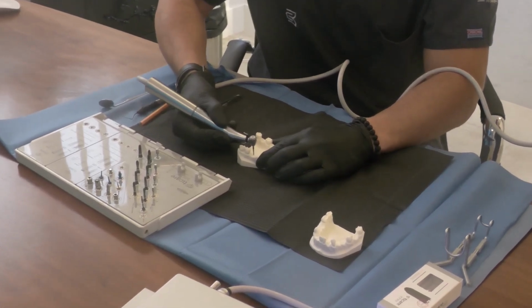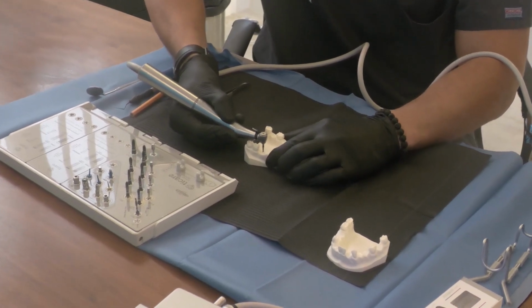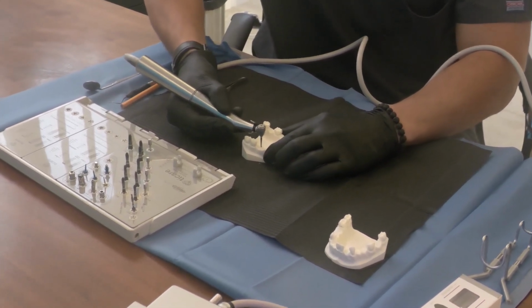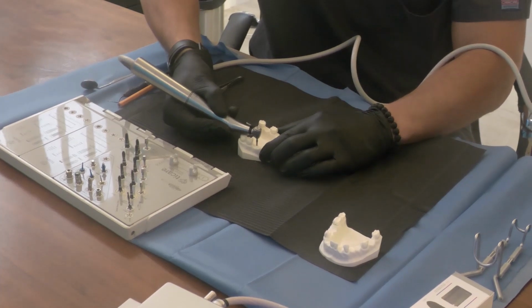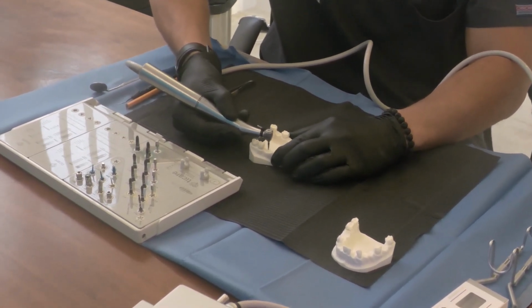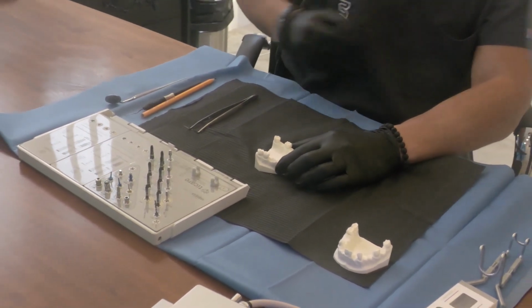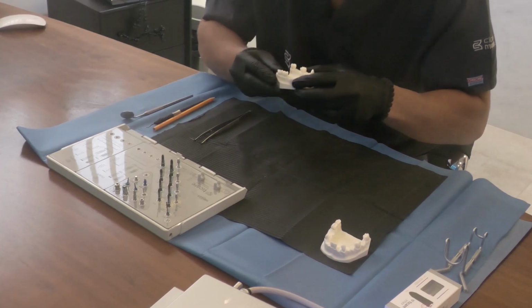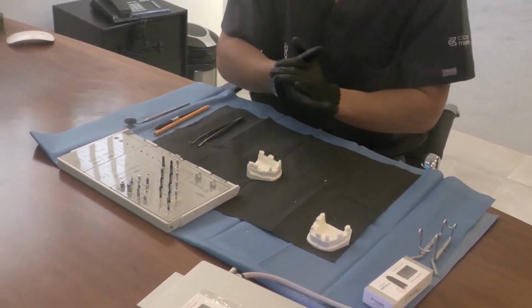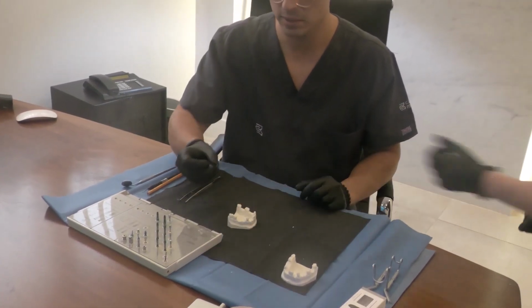with profuse irrigation. Of course, this is not applicable here in this model, and the motion always has to follow an in and out motion in order to get rid of all the debris related to the bone, and in order to have irrigation reach the apical portion of the drilling area to minimize overheating.